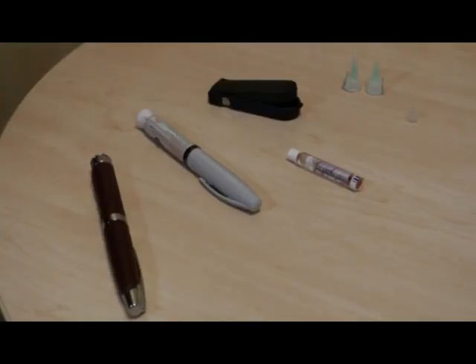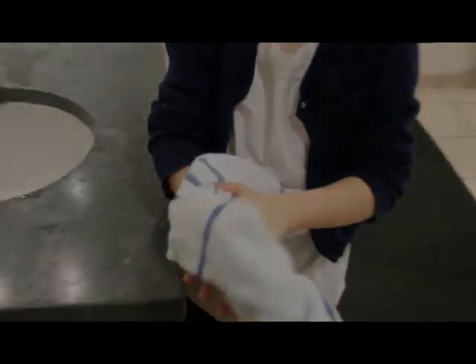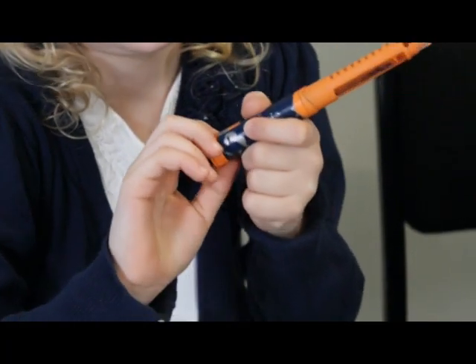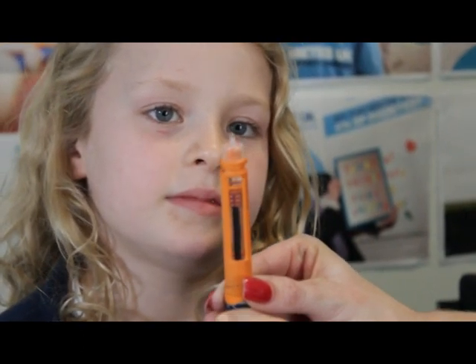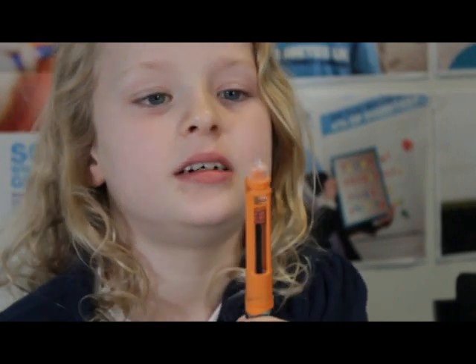All of these items are available on prescription from your healthcare team. Wash your hands with warm water and dry them thoroughly. Prime the pen: attach the needle to the insulin pen, dial up two units and hold the pen upright, then press the plunger. Insulin should appear at the tip of the needle. If not, repeat the process until it does.